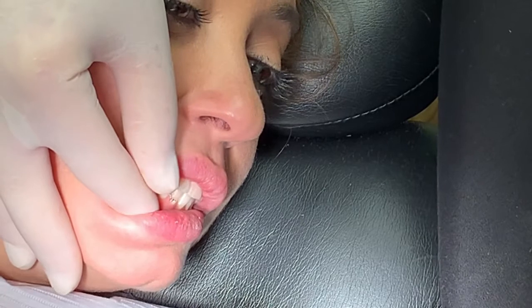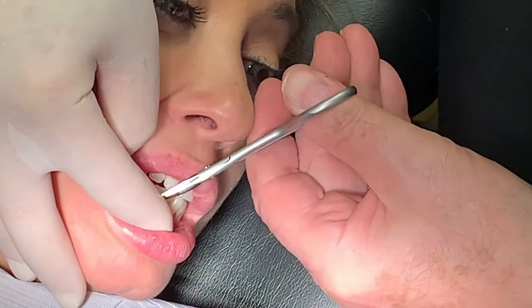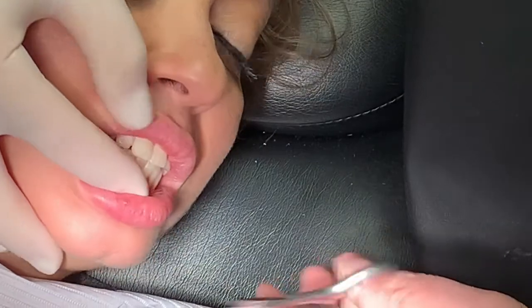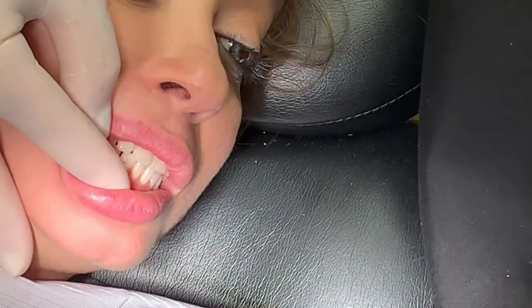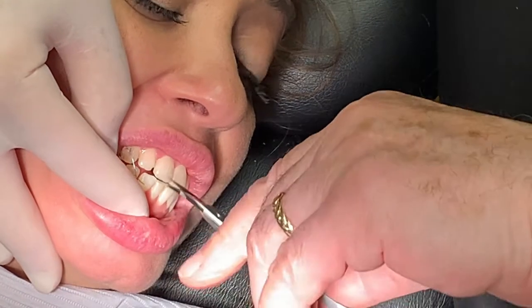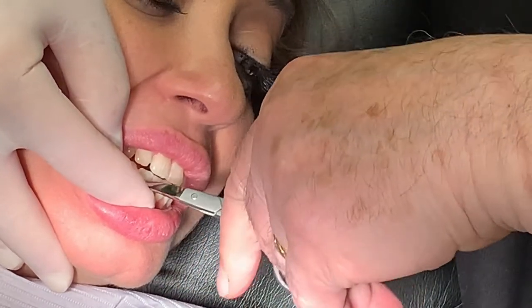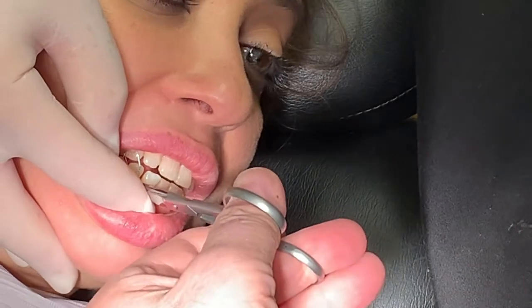So you take your little scissor, which is part of your kit, and then cut off the tip. Take the excess out of your mouth, right? And then take the little piggy tail, it's done, and tuck it in and out of your way. Okay. Turn it in, and then turn it back and tuck it in.